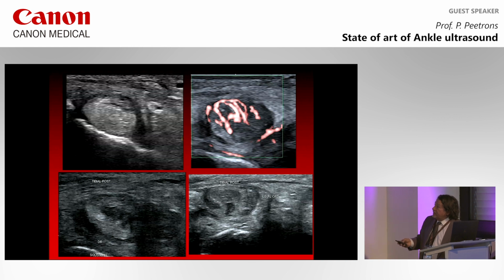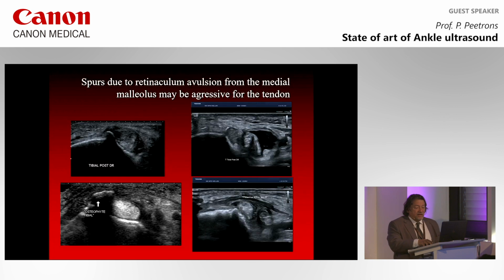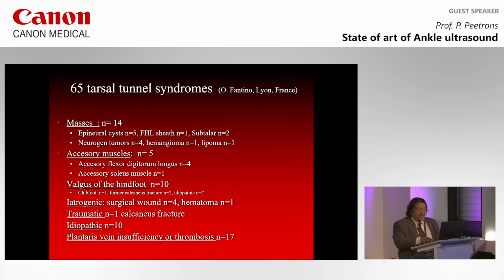This is this one, I think. I'm not sure, but it looks like, and you can see hypervascularization. This hypervascularization is very important. I will go to the end.